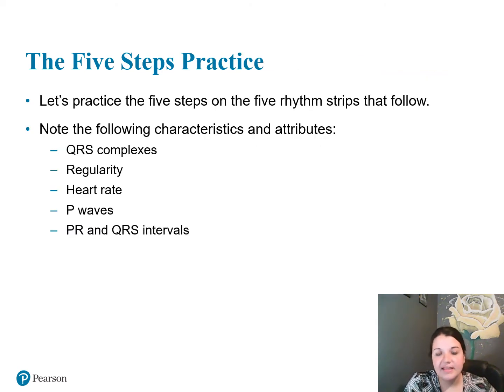So, let's go ahead and practice these 5 steps of rhythms that follow. Note the following characteristics and attributes. Your QRS complexes, that's your first question. Yes or no? Do we have them?